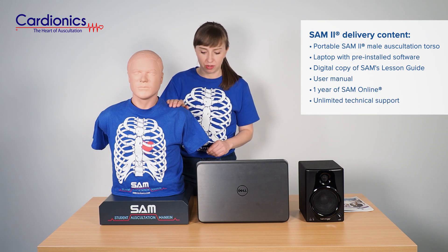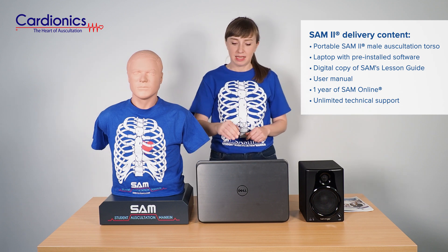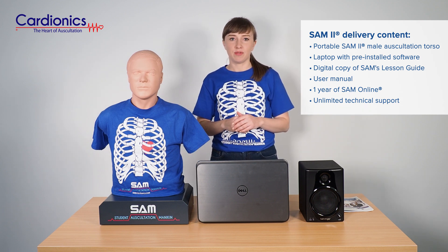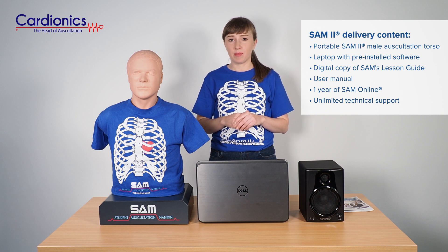SAM2 Auscultation Training Torso, which is mounted on the base and comes with a t-shirt. A laptop with pre-installed software, which allows you to access Cardionics' library of heart, lung, bowel, and bruit sounds, as well as set up programmable and password protected lectures and exams.